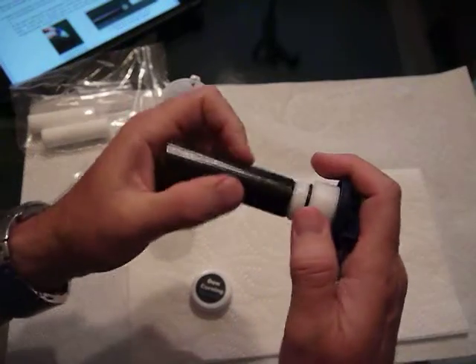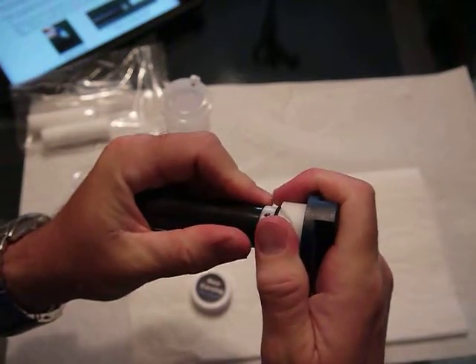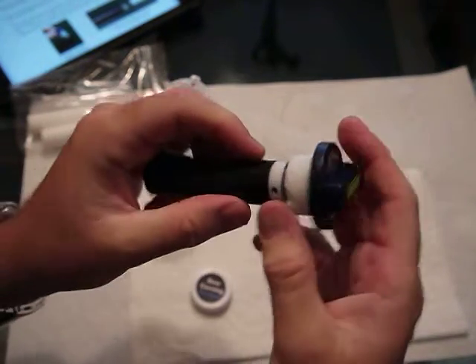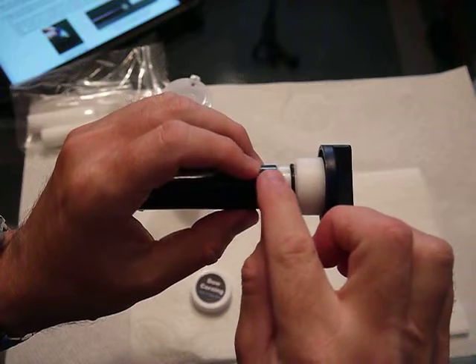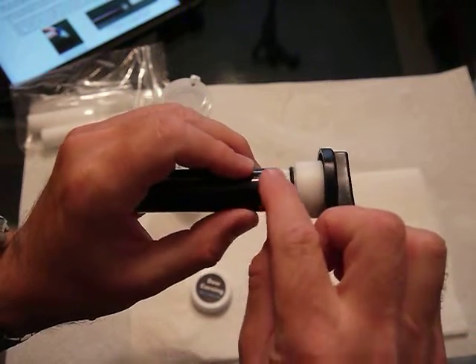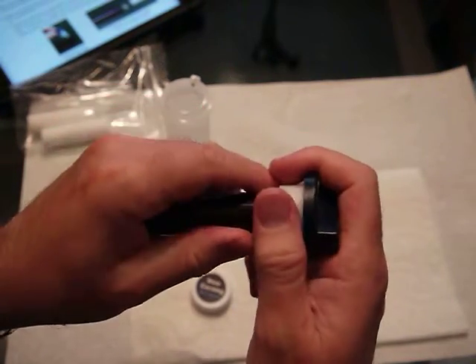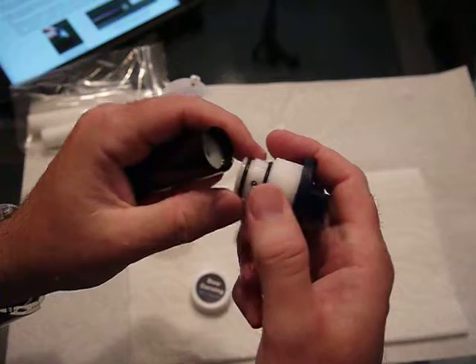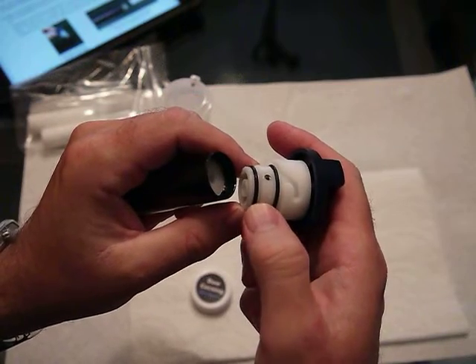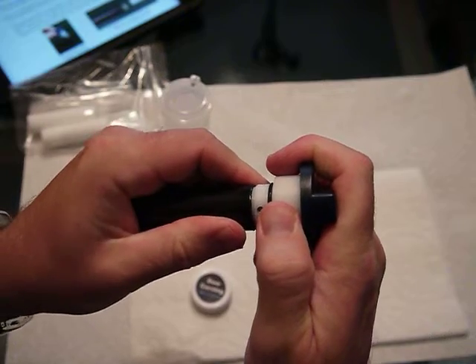Okay, now take this. I don't want to force it directly together, but I'm going to watch it. I'll start to, that looks like it fit in there pretty good. I have seen this where you go to put it together and the O-ring, you can see it kind of bunching through here or not staying very consistent. If it does, you can take it off and try again. And if these are damaged, they should be replaced. Both are important to the operation. So I'll pop this back on here again.